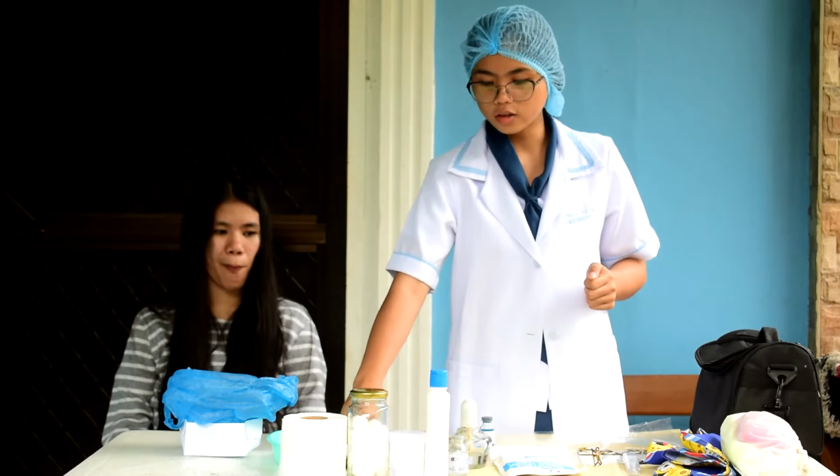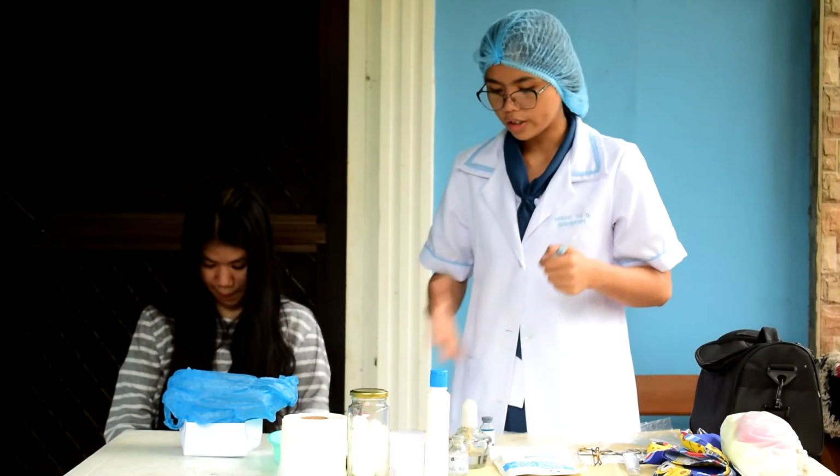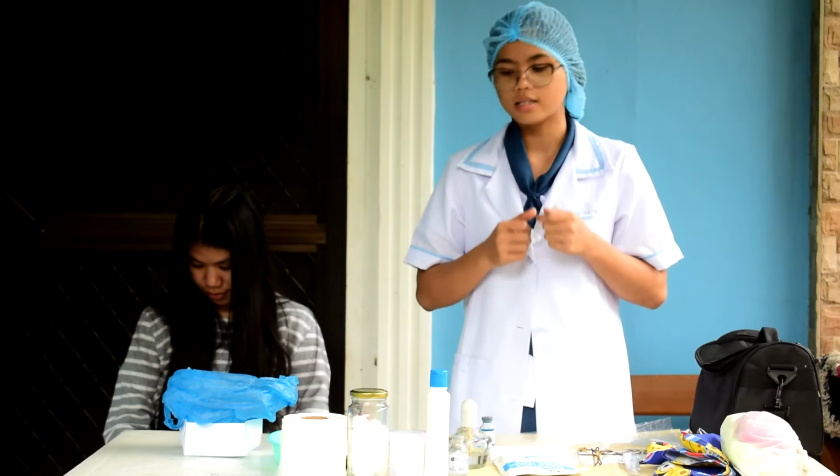So, okay po, ma'am? Okay. So, when you have to start, what do you do? Open your Benedict solution and your pipette. You get 5 ml. After that, you pour it over your test tube. When you pour it, make sure it is on top of your waste receptacle, so as to avoid spillage, or if there would be some spillage, it will not contaminate your working area. And after that, you place it in your medicine glass.